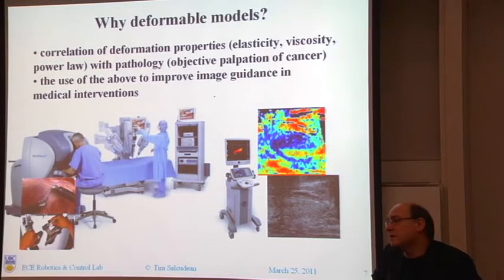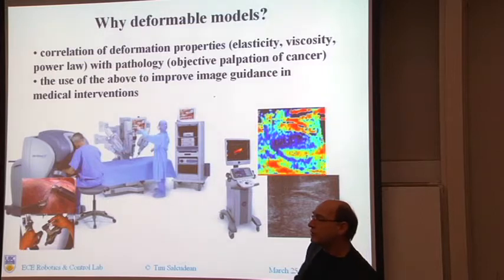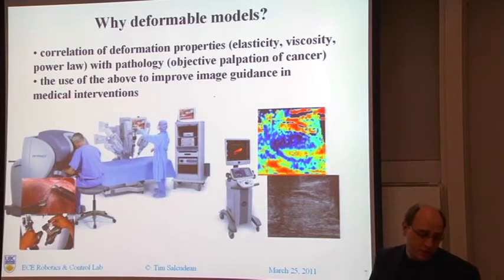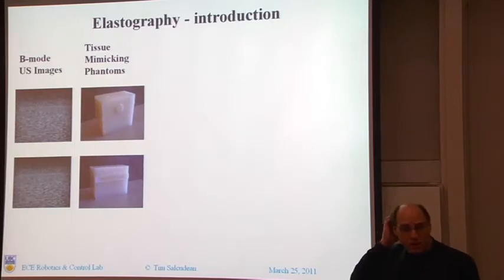We also want to correlate deformation properties to pathology. This is basically to replace the standard form of palpation that you go to see the doctor with something that is actually objective, that gives you a number, it gives you an image. And we will see that actually this can be used for surgical guidance as well.